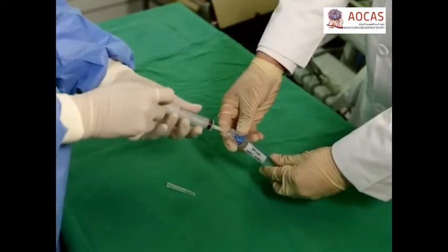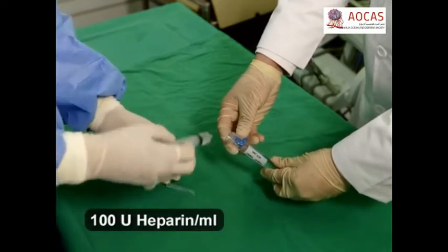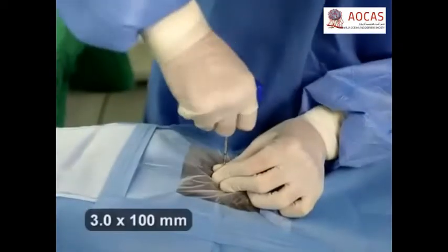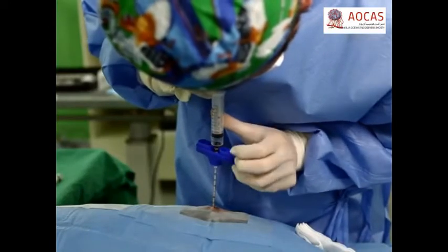Now, pre-coat a 10-milliliter syringe with heparin using a 3-4-milliliter rinse. This will prevent the bone marrow from coagulating while it is extracted. Then, precisely at the iliac bone crest, tightly attach a bone marrow extractor to the heparin-coated syringe and extract at least 5 milliliters of bone marrow.